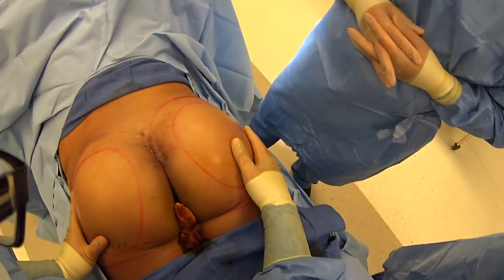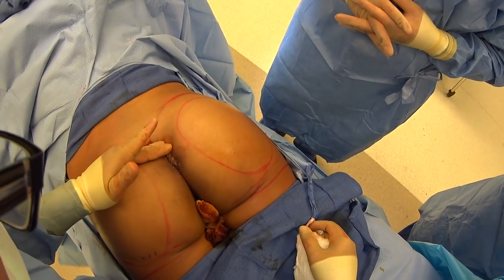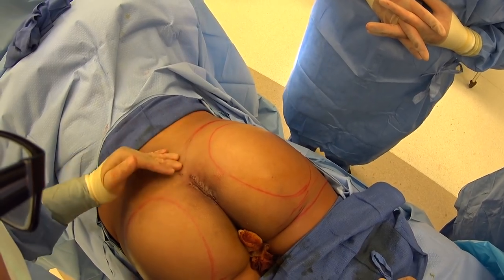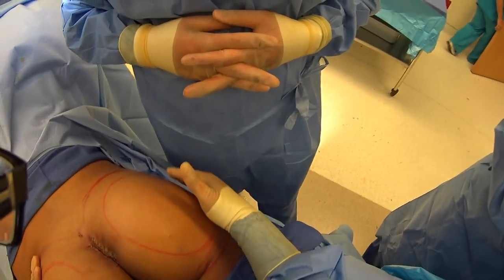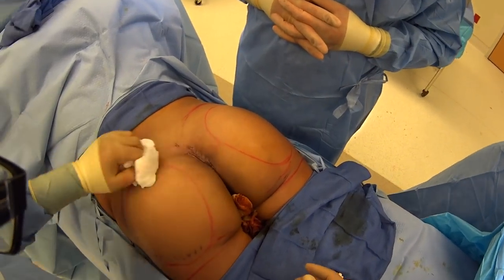Here we've completed our butt augmentation with the implants. You can see how the incisions are well hidden below her butt crease. One little incision here — we did liposuction so that her panties will sit nicely. Now we're going to do some fat transfer to fill out this hip area, round out a little bit of the bottom butt here, and just do some fine tuning — it's kind of like the icing on the cake.